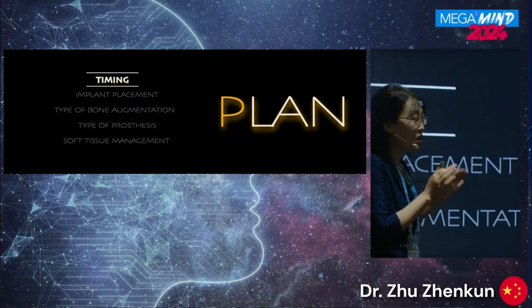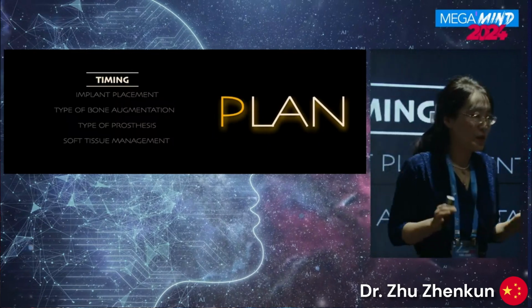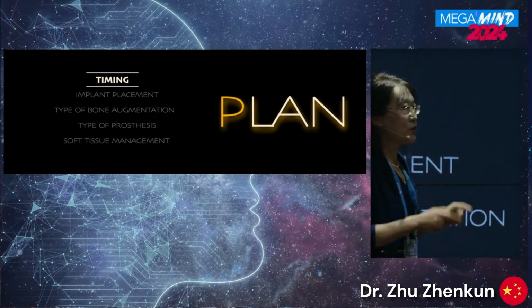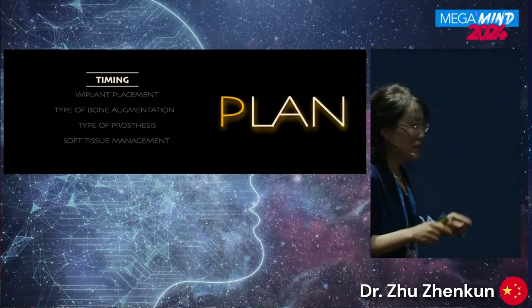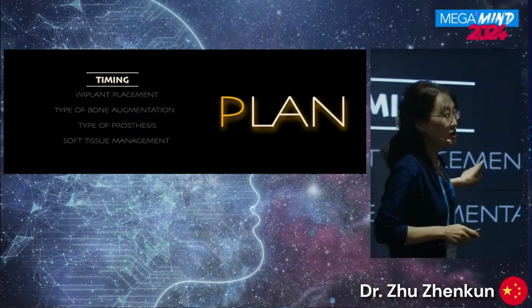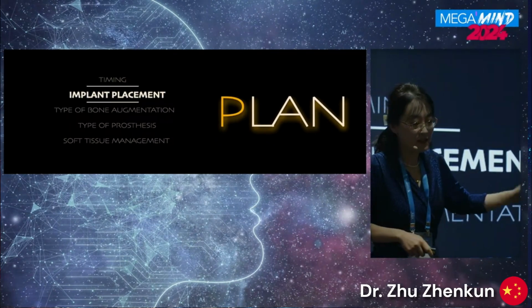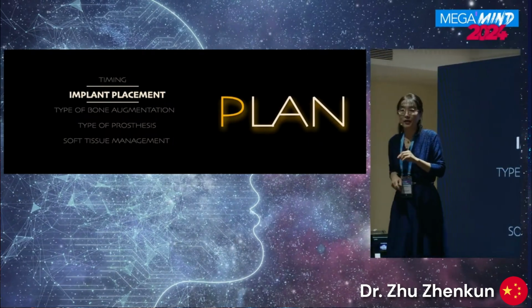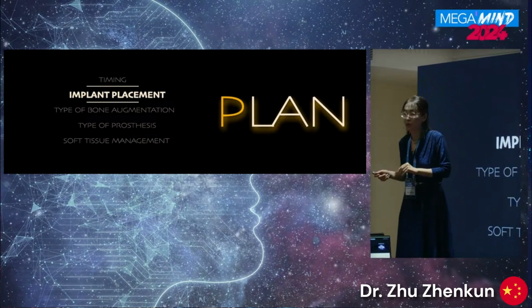Immediate implant placement can reduce the surgical procedures and shorten the treatment time. But we need to select the patient very carefully, because the patient should meet the indications for immediate implant placement. And we emphasize that an ideal aesthetic position of the implant is required, because it helps to maintain the soft and hard tissue.